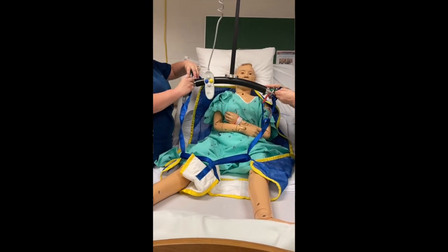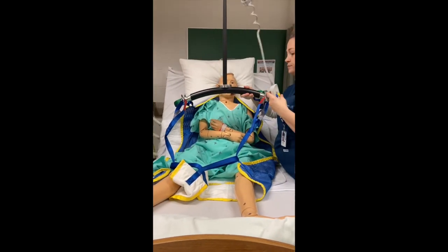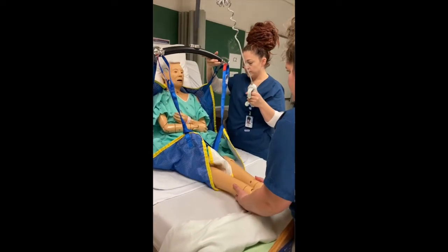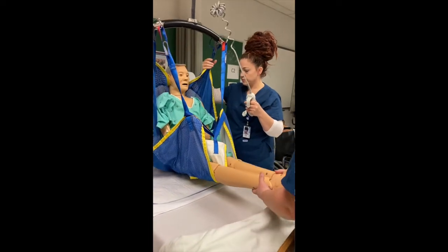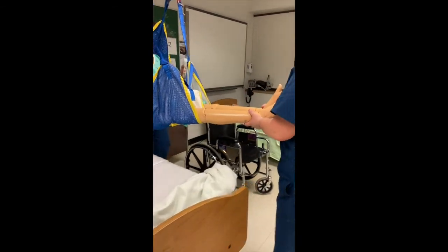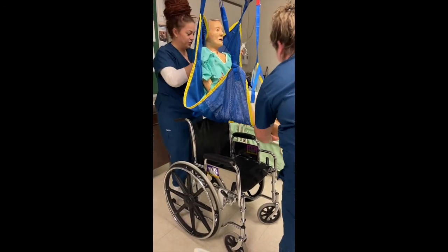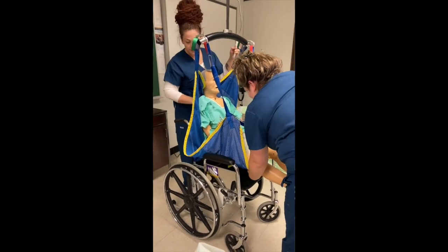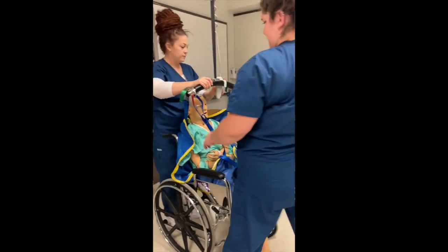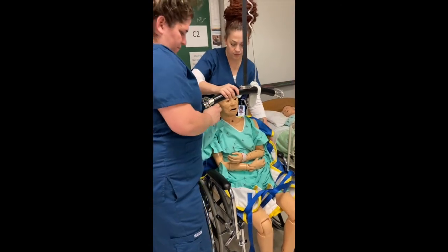After hooking the straps onto the mechanical lift, Tiffany mobilizes the feet and legs while I bring the lift up and over to the wheelchair. Abby lowers the patient while I continue to stabilize them and ensure that their body is well supported. We unhook the patient and make them comfortable for the day.